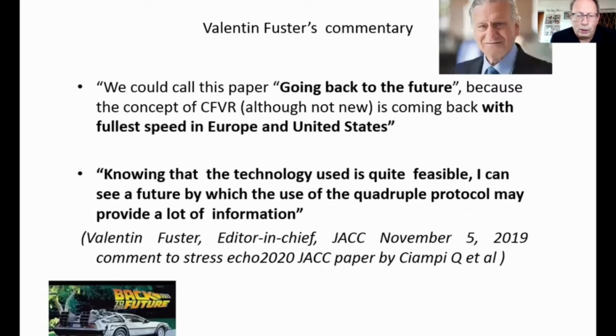And one by one, in the last 5 years, A, B, C, D, E steps were added to the core stress echo protocol to achieve the elusive goal of the assessment of the patient vulnerability much above and beyond coronary artery stenosis.